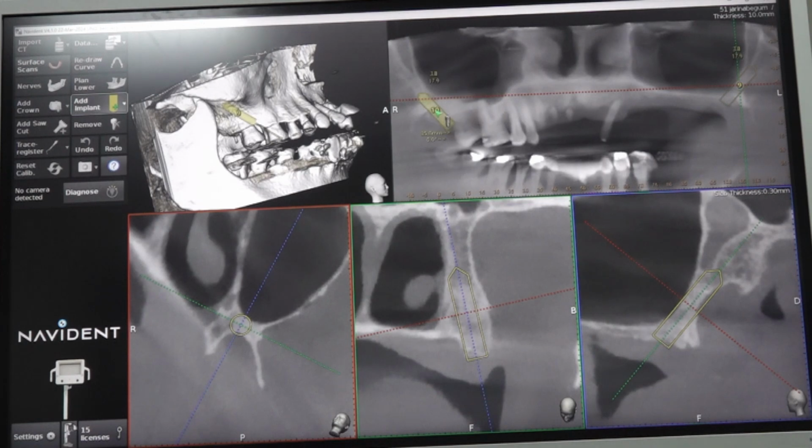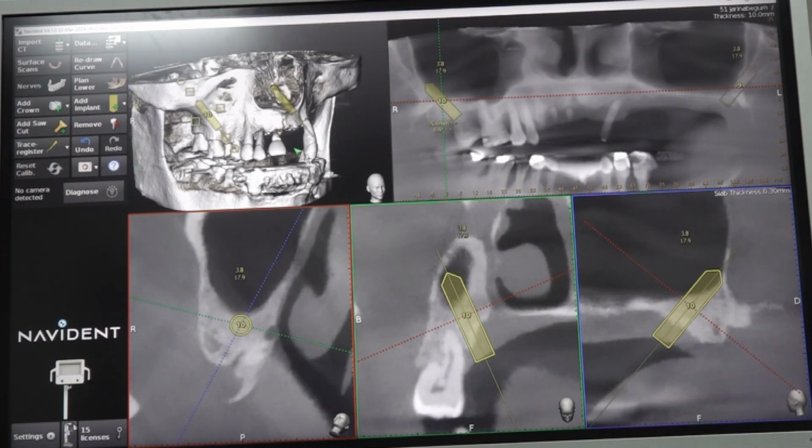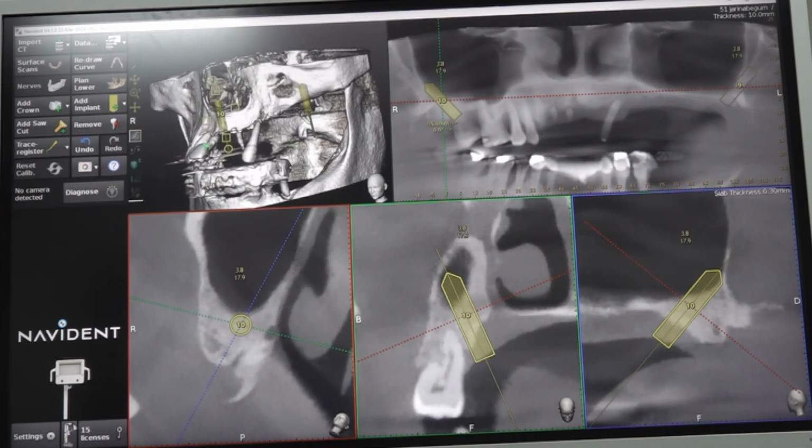Now we will see the right pterygoid. So even before we do the extraction, we just remove these very mobile teeth, 1 2 3, extraction, and finish the pterygoid first. Okay, that will be a better idea because if you do extraction of these two, bleeding will be coming. So better if you finish the pterygoid first.